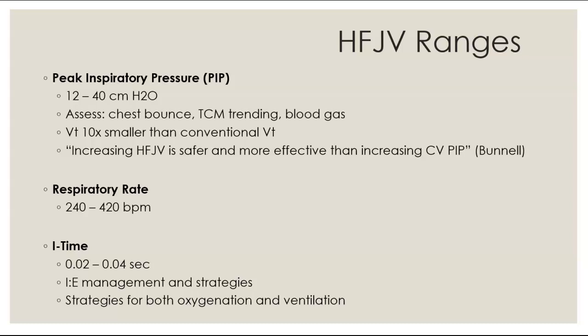Because we risk barotrauma, we risk insanely high peak pressures with increasing PIP on a conventional ventilator, but because we have that passive exhalation and decreased risk of air trapping, the high-frequency jet ventilator is a lot safer to just increase your PIP. When in doubt and you can't get your CO2 managed, my knee-jerk reaction is going to PIP. Sometimes I'll go to rate, but most of the time I go to PIP, and I will up my PIP before I touch my rate until I'm getting significantly higher.